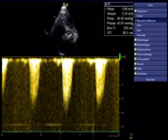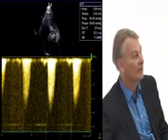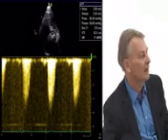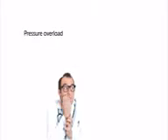So here we are. We have a stenosis which is somewhere in the range of moderate to severe. The mean gradient is 40 millimeters of mercury. The maximal gradient is somewhere in the range of almost 60 millimeters of mercury. So this certainly could be her problem. When it comes to aortic stenosis, what are we really afraid of? A few things. First of all, pressure overload, because this can eventually lead to heart failure.